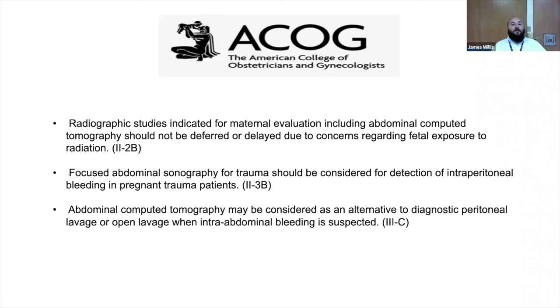This is actually a policy statement from ACOG regarding pregnant trauma patients. What it says is that the radiographic studies indicated for maternal injuries, including CT abdomen, even though they will get exposed to the radiation, if you have a high suspicion, pretty much do the test. If you have a high clinical suspicion for intra-abdominal injury, don't be afraid to scan them. They should be evaluated the same way as the non-pregnant patients.